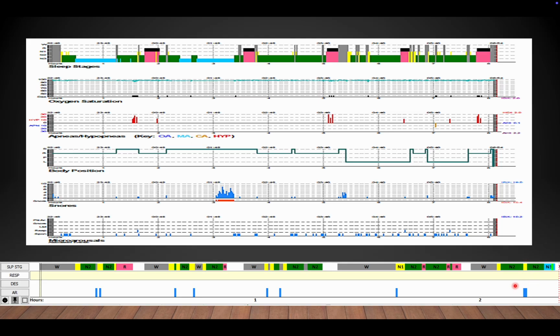Why? Sometimes we may end up doing that also. In this patient, if you look at the fourth nap, the sleep latency was prolonged, and if we were ending here, sleep latency would have been just close to 10 minutes, in the borderline or gray zone area.